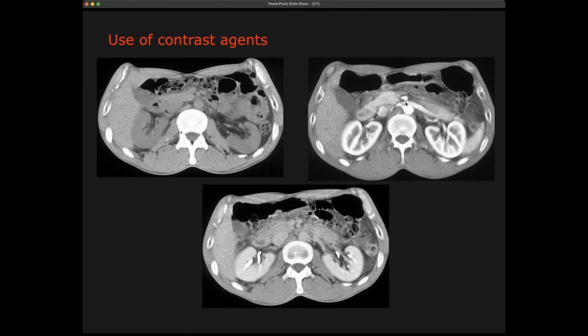So in the initial phase, we start to see a lot of contrast, so a lot of blood within the vessels and within the highly perfused organs. You start to see some contrast in some other organs here too. If we wait a little bit longer, the contrast is out of the aorta. There's almost no contrast anymore; it's almost the same gray value as initially.